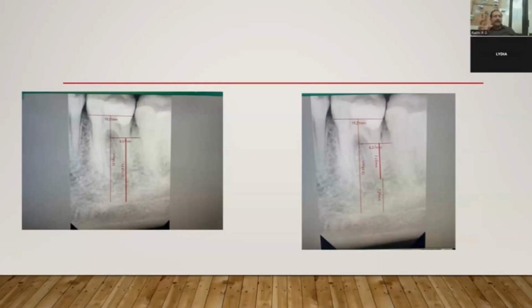You should have a fair idea of how the jumping space is going to be, how much bone is to be augmented. Accordingly, you make a decision on using bone graft, PRF and barrier membrane. Okay.